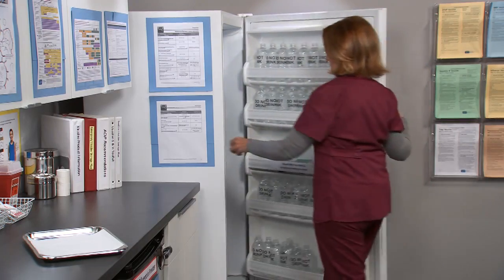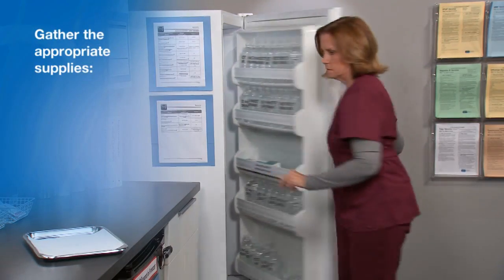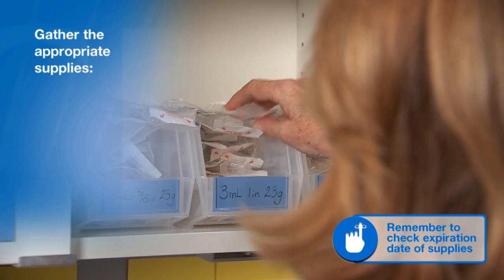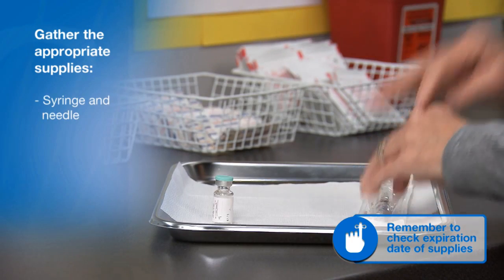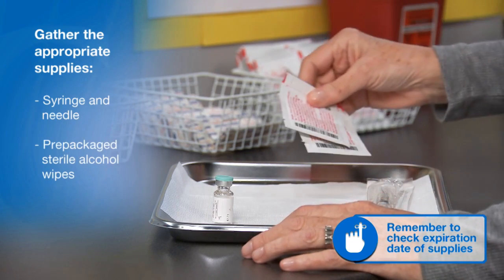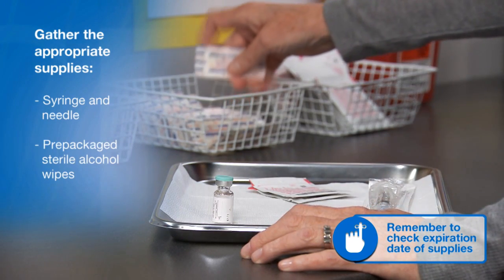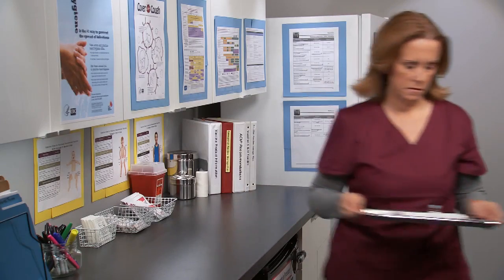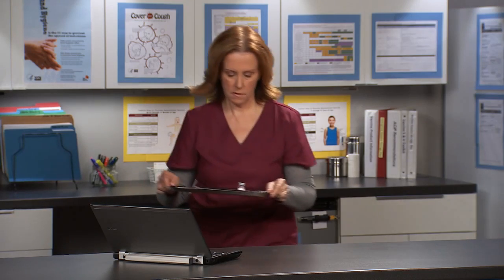Next, gather the appropriate supplies. This includes a syringe and needle, prepackaged sterile alcohol wipes, and bandages. Needles and syringes may be packaged together or separately.